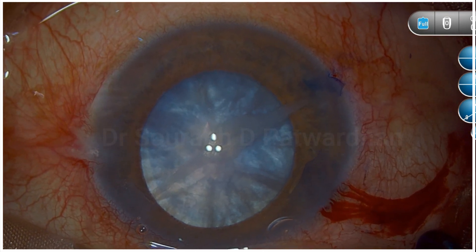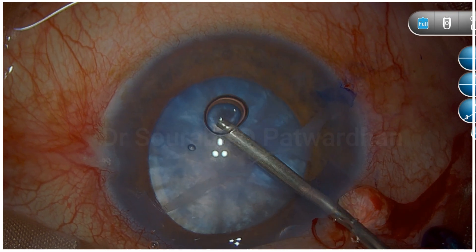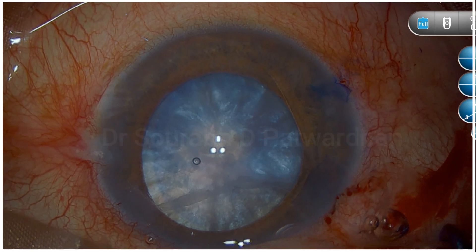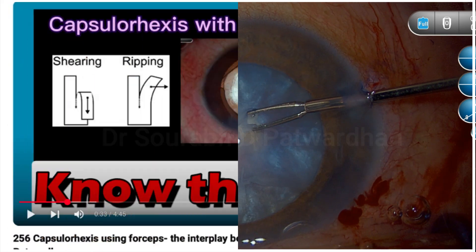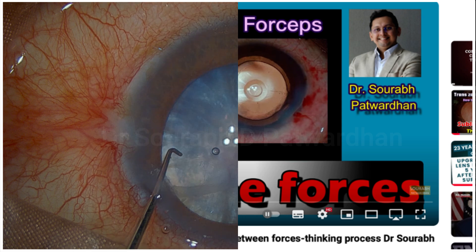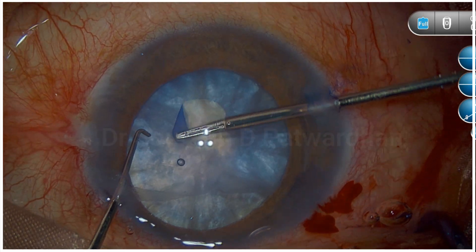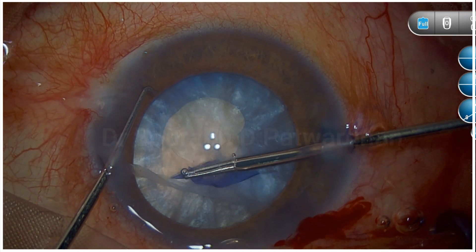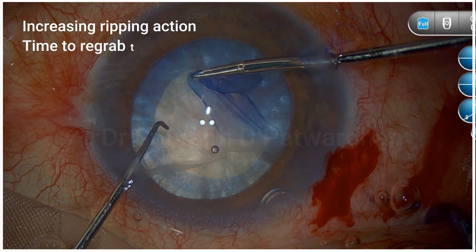Using a heavy dispersive OVD here to flatten the anterior capsule, and then using micro forceps from the small incision. If you haven't seen this video of capsulorrhexis with forceps, go search on my YouTube channel — I will also provide a link. When doing capsulorrhexis using forceps, though here we have negated the intumescent pressure already, you can see whenever there is an increasing ripping action it is time to regrab the tear, otherwise it's going to go out.